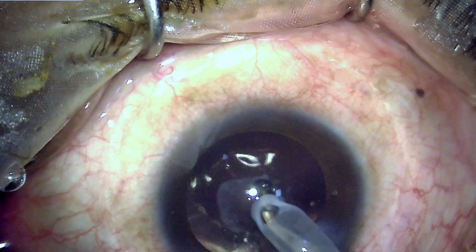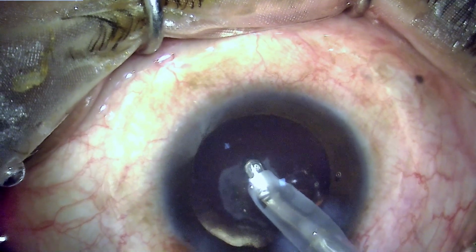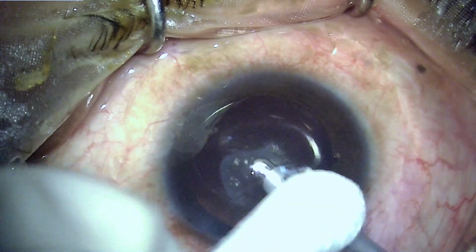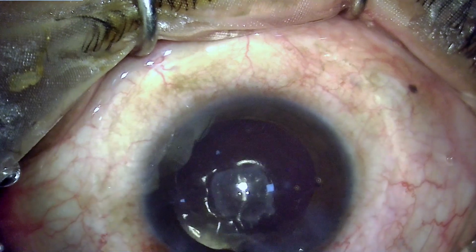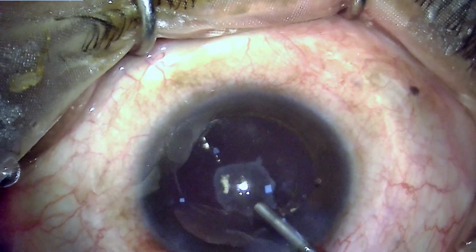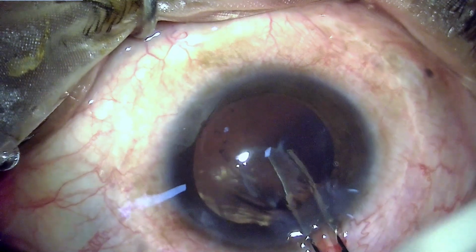We can also appreciate this plaque, which is just not able to be peeled using an irrigation aspiration cannula. This is usually a feature in these cataracts, and again when exiting, one has to take care that the chamber doesn't collapse immediately, and one has to replenish the viscoelastic so as to maintain the space in the anterior chamber. The plaque has a definite edge which is definable, so I decided to see if I can hold this plaque and peel it away if it is possible.